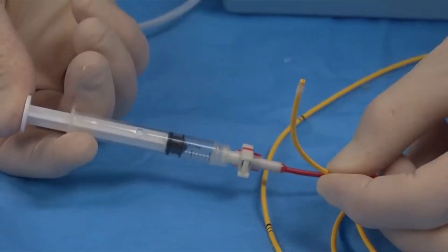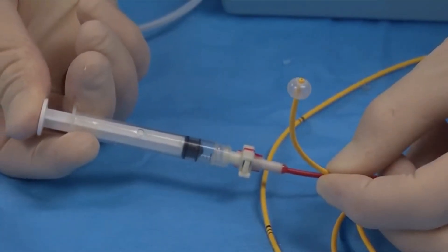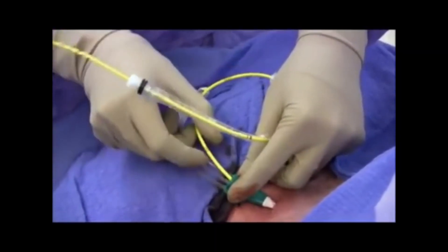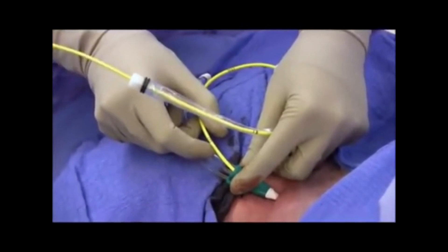Number 11: The balloon is then tested for integrity. Number 12: The catheter is then inserted via the introducer.